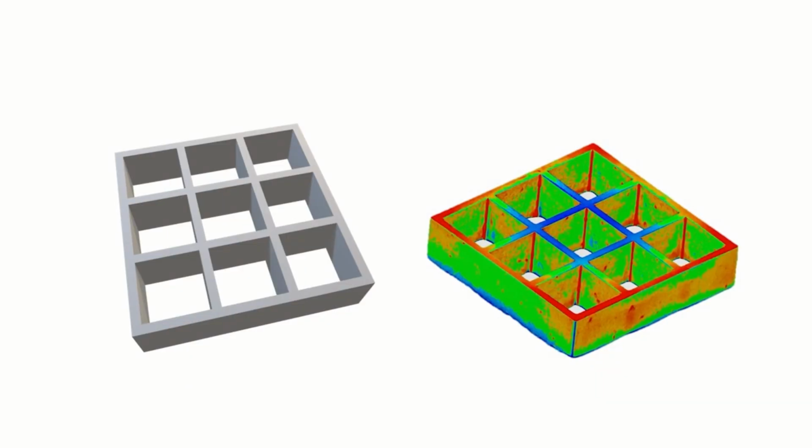In this section, I would like to introduce a test model that I have designed and use specifically for accurately measuring and understanding polymerization shrinkage and overextrusion. This model is crafted to precisely evaluate these phenomena in 3D printing. By printing this model at various scales, we aim to find the point at which the discrepancy between the interior and exterior dimensions of the model is minimized.